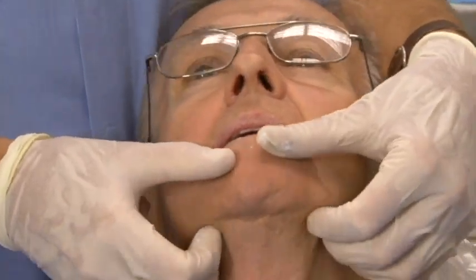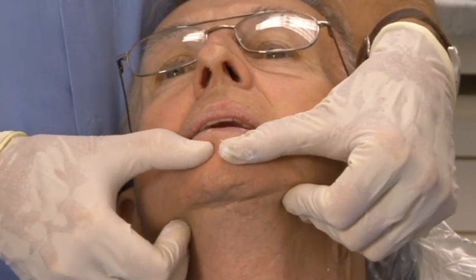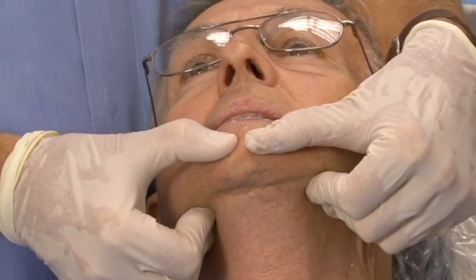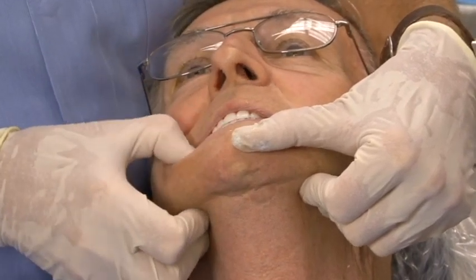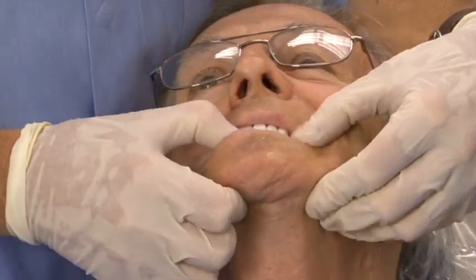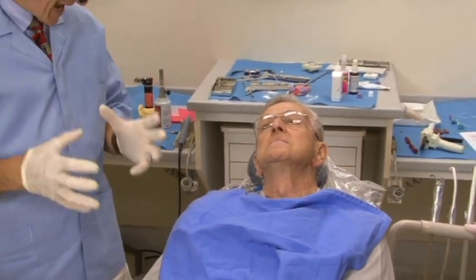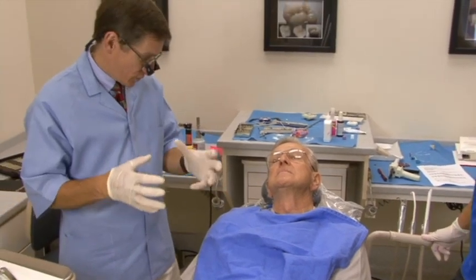I'm going to put just a tiny bit of sticking. I can load his joint up, close him straight up, and he's right on the money. Count 1 to 10 one more time. 1, 2, 3, 4, 5, 6, 7, 8, 9, 10. I feel real good about that. So our next appointment, what we'll do is insert the diagnostic denture — the approved provisional denture.